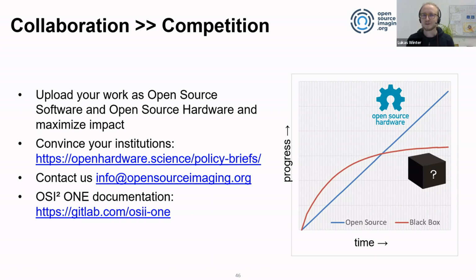So let's say for this part, we are also observing. We're also not sure what would be the final console. For example, we will test some other cards we have, some arbitrary waveform generator cards, which are very flexible, can be connected over PCI Express, and if you need more transmit channels, you just buy a card, plug it in and that's it. If you need more receive channels, you do the same. So for research purposes, that's pretty cool. But for this, let's say, affordable system, I'm not sure yet.